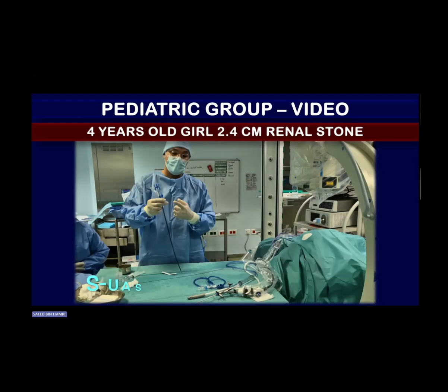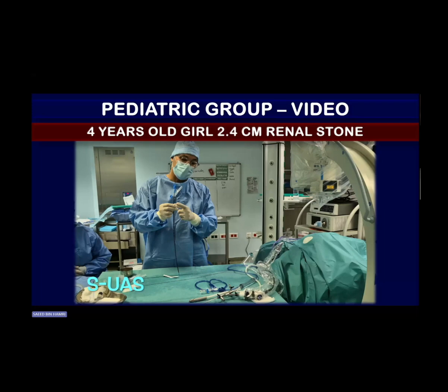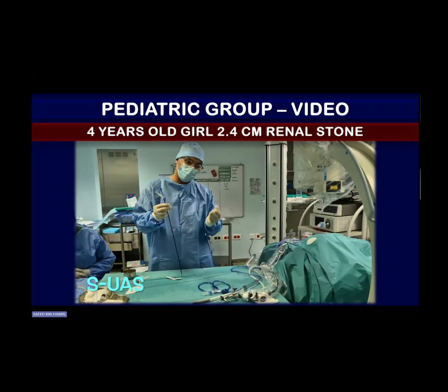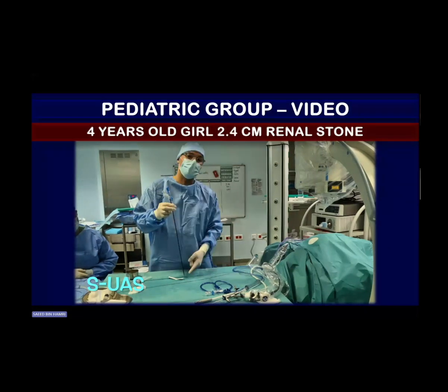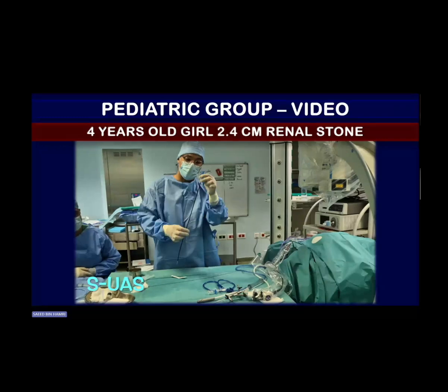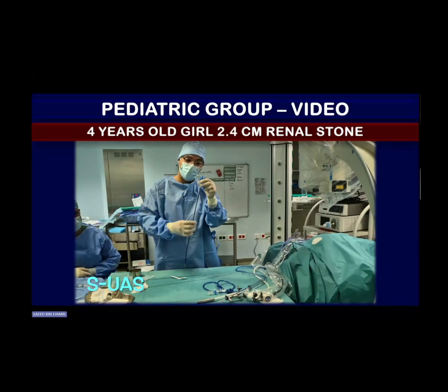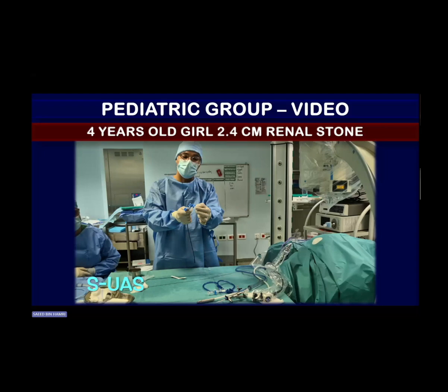We use an access sheath with suction, as you can see here. Unfortunately, we don't have the 20/25 for the baby 6 years old and below, at 20 centimeters. Here we have one option which is 40 centimeters. We have to work around. So we need suction to avoid any increase in the renal pressure. And this system contains a very fine 10 French, very small hydrophilic sheath, and the part here, as you can see, to control the pressure.